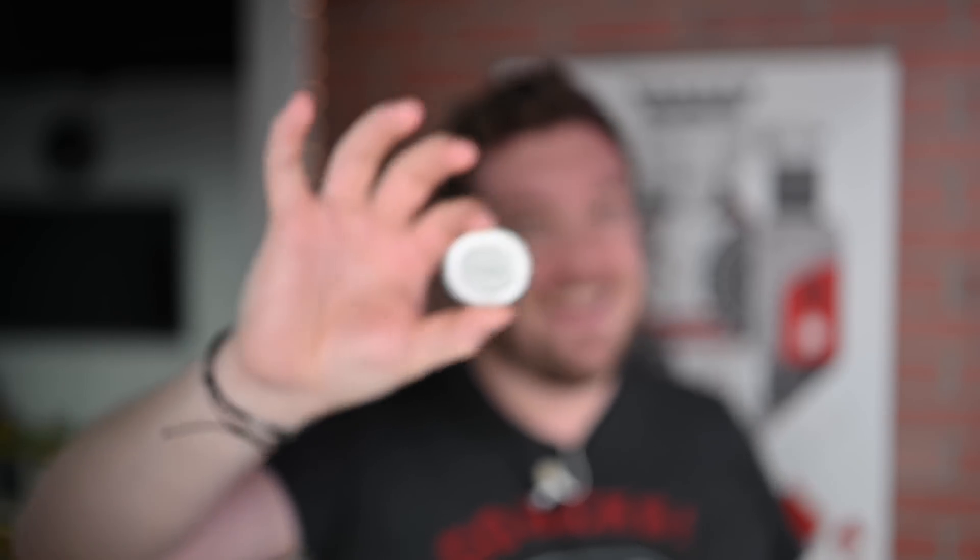Are you seeing this right now? I am beyond excited because this is the Dexcom G7, and after finally getting FDA approval in early December of 2022, this guy is about to start hitting the market. In this video, I'm going to give you a first hands-on look at the Dexcom G7 continuous glucose monitor.